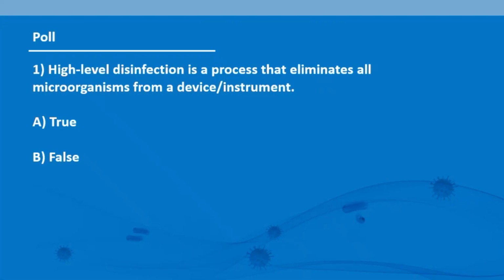So this is the first of our poll questions. High-level disinfection is a process that eliminates all microorganisms from a device, true or false? Now the answer is false, and I'll explain in the next slide.